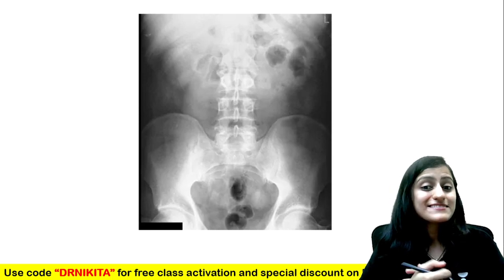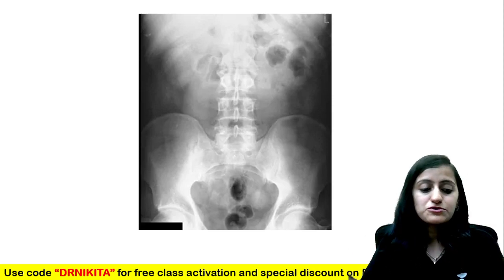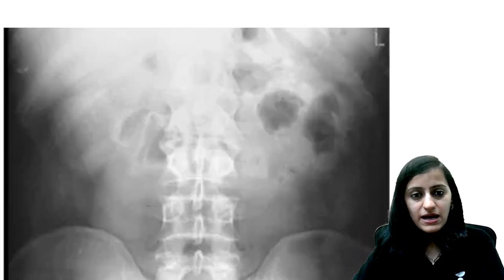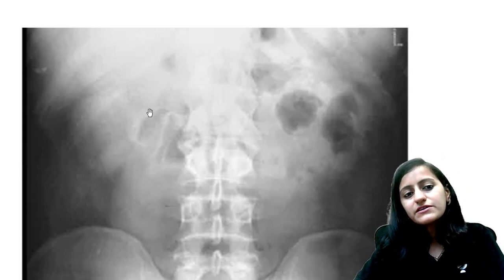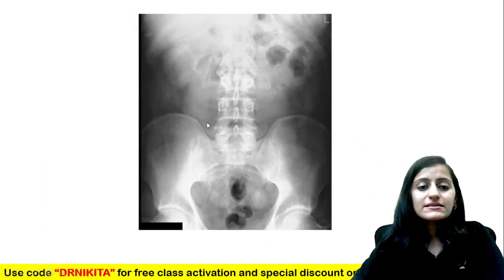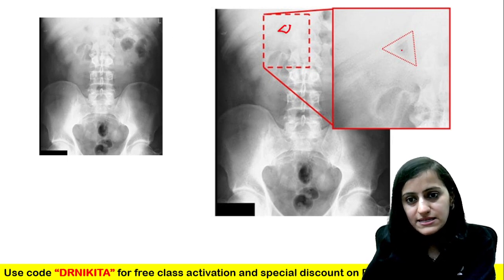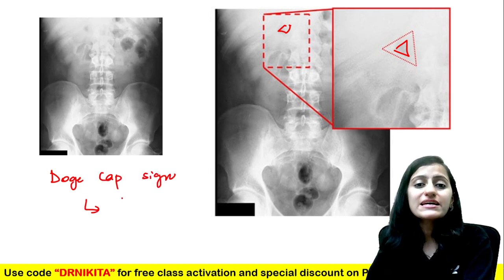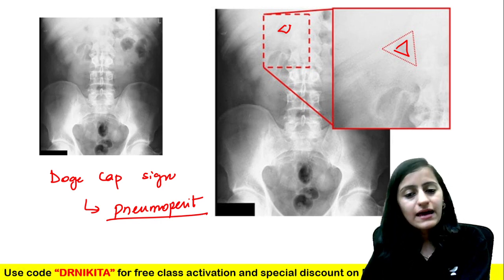The next image is a bit difficult but very important. Zooming in on the right side, there is a triangle-shaped collection of air between the liver and the kidney — in Morrison's pouch. This air in Morrison's pouch is called the doge cap sign, which is basically free air in the peritoneum — this is pneumoperitoneum. This is a very, very important sign to identify.